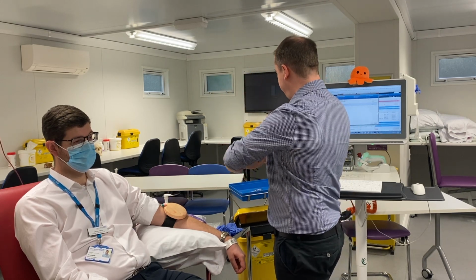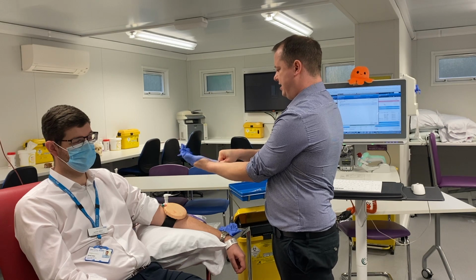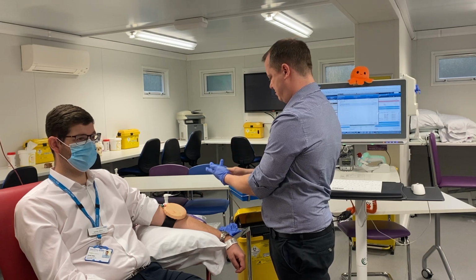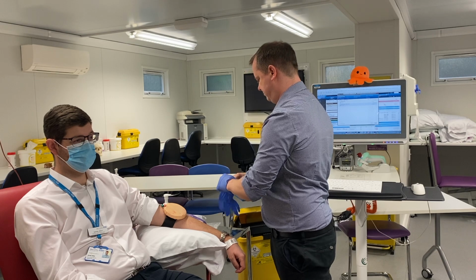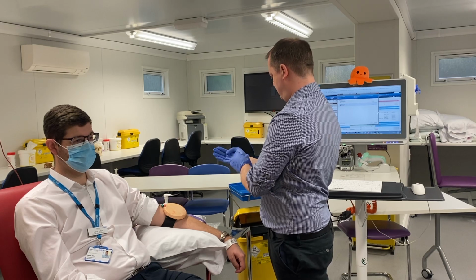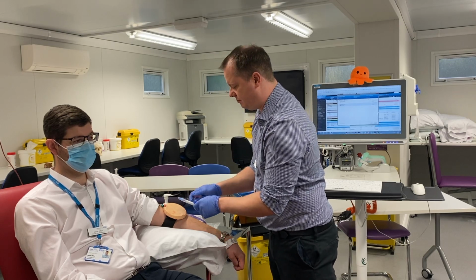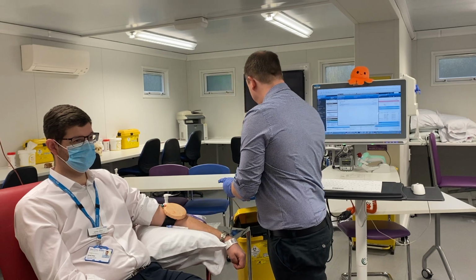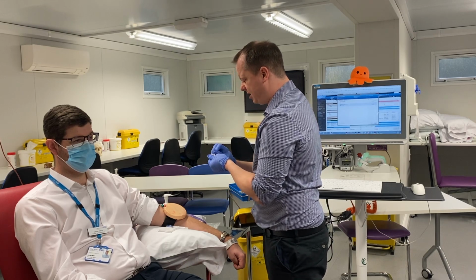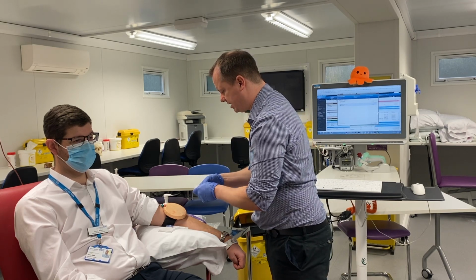I want to give my hands a good clean. I need to get my gloves on at this stage. Now, what I can do is place my sharps bin where I will need it. I'm going to put my two bottles next to my patient, and then I can also put a bit of gauze next to the patient. I can also then clean the patient's skin, because I know I'm going to be sticking the needle in, with my alcohol, and that could be drying while I am getting the rest of my stuff together.